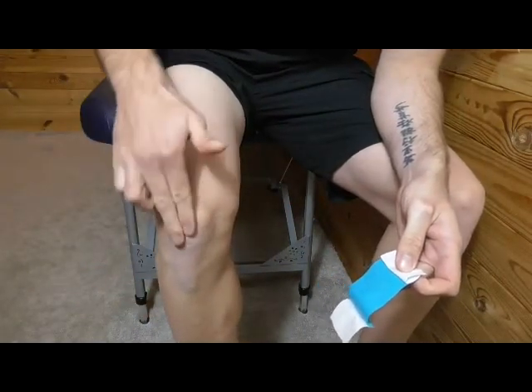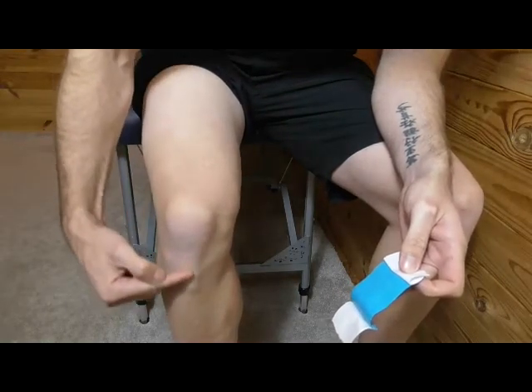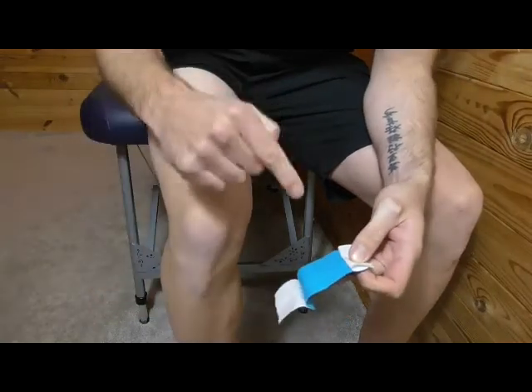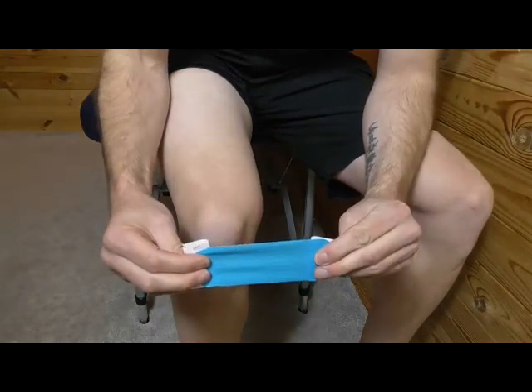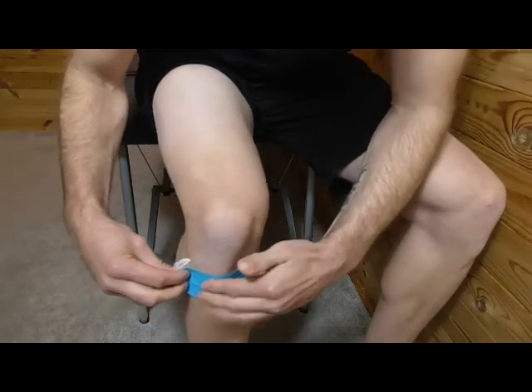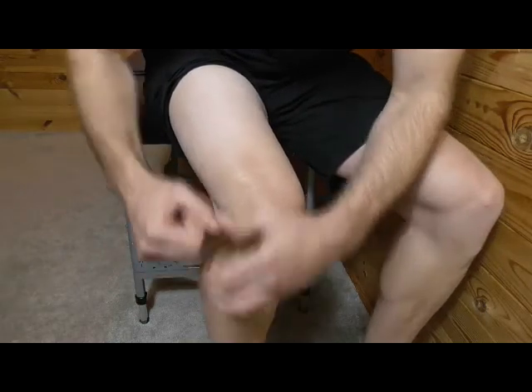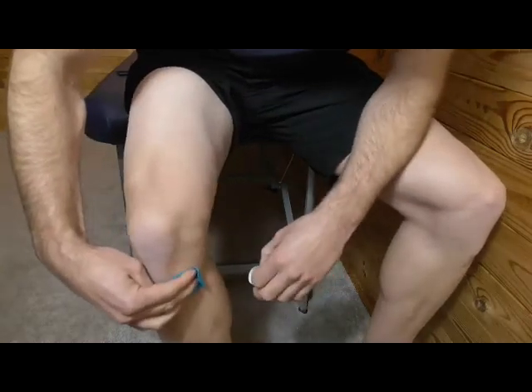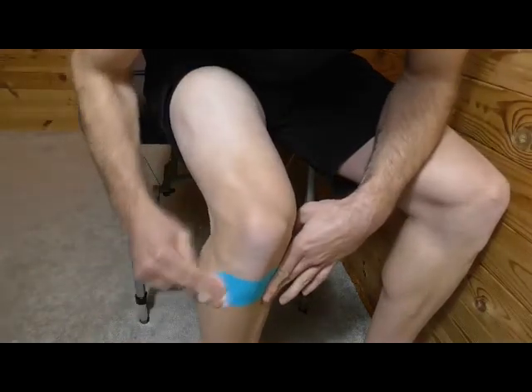This is going to go across your tibial tuberosity. Find the kneecap, go over it and you'll feel a slight dip, then a bony part at the top of your shin — that's your tibial tuberosity. Stretch to 100%, then back off to 50%, and place it down with no stretch on the ends of the tape so it doesn't ping off. Do the same on the other side, then give it a rub to warm the glue up.